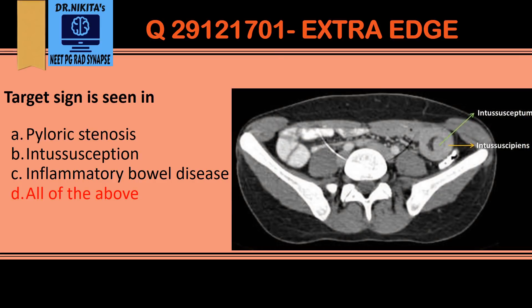The target sign is also seen in intussusception. On this contrast CT abdomen image — where vessels and bones appear white — one bowel goes inside another. The outer bowel is called the intussuscipient, as it is the recipient, and the inner one is the intussusceptor. The inner circle is formed by the intussusceptor and the outer circle by the intussuscipient, giving the target or donut sign.